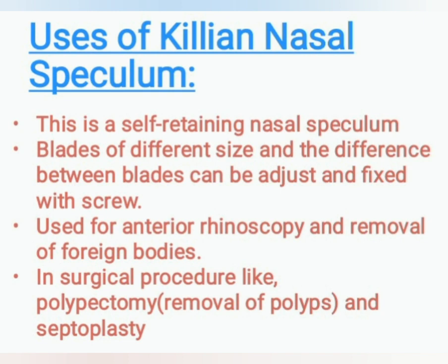This is a self-retaining nasal speculum. Blades of different sizes, and the distance between the blades can be adjusted and fixed with a screw. Used for anterior rhinoscopy and removal of foreign bodies, and in surgical procedures like polypectomy, meaning removal of polyps, and septoplasty.